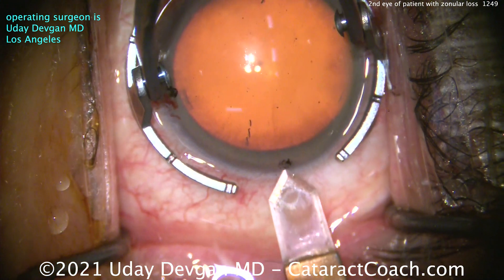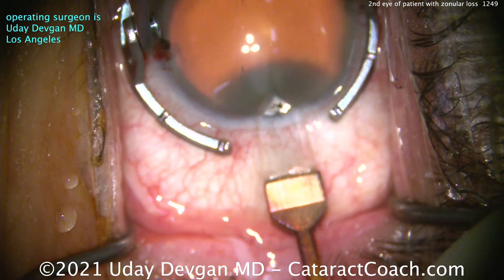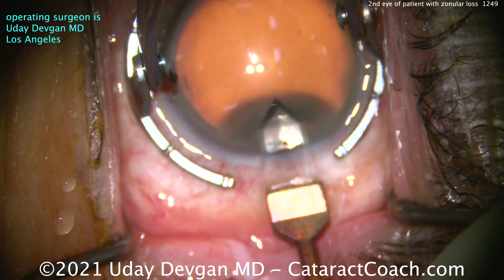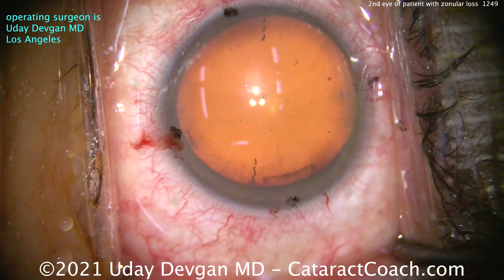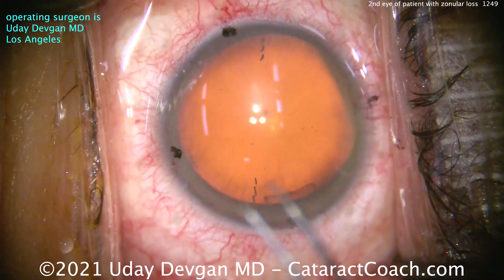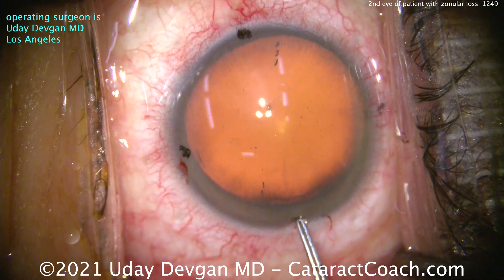I'm going to make this incision here. I'm not going to worry about making it on the steep axis in this video. Why? Because the first eye was such a struggle — if I have to do the same kind of maneuvers, I do not want to have to shift my hand into some odd position. So I'm slightly off, still against the rule, but slightly different. Now here's the most important thing.